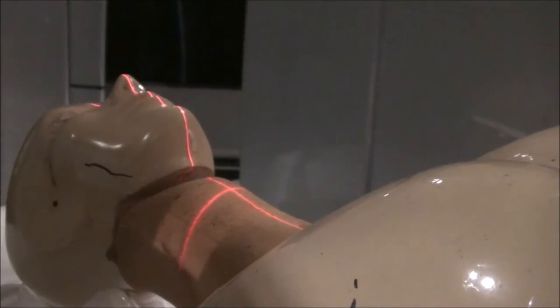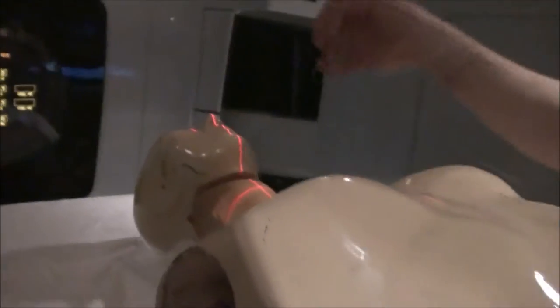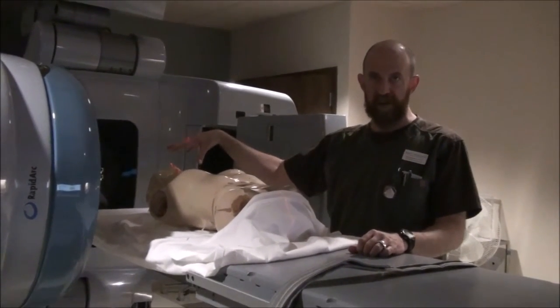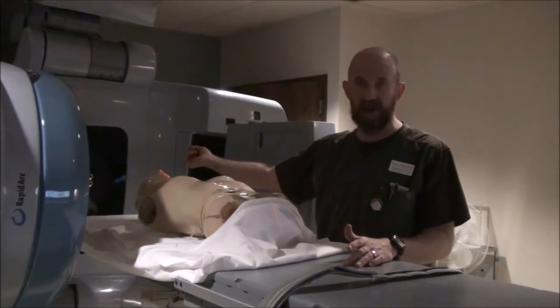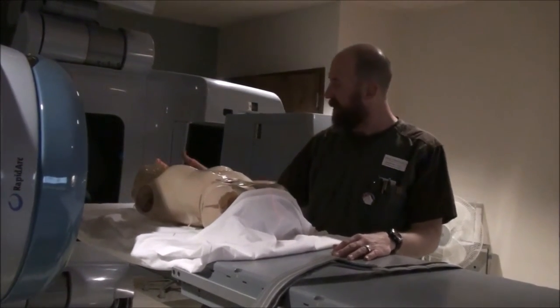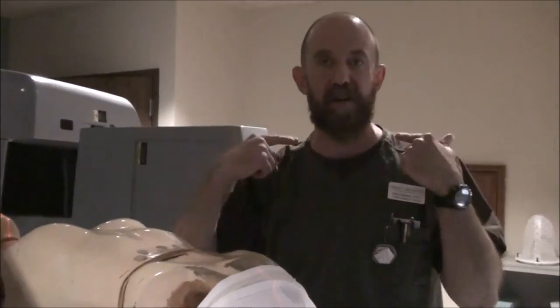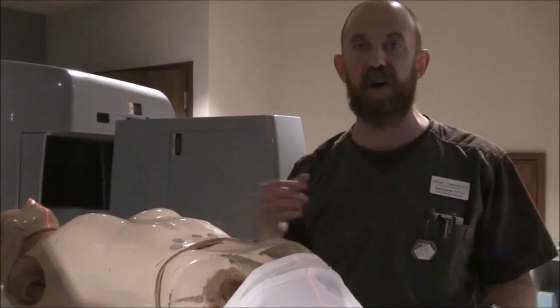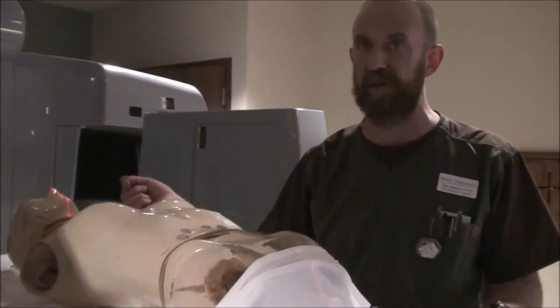Once you've taken that film, you're pretty much done. You're going to take pictures — a lateral, an anterior, and a full body. When you make a mask, if you use a short mask, make it such that the mask goes far enough down on the neck that you can put the marks on the mask. If you use a long mask, it's going to naturally hold the shoulders in place, and you'll be able to put your marks on the mask as well. If you don't, you'll end up with marks on the patient's skin, which is fine — but it's difficult to reproduce every day.